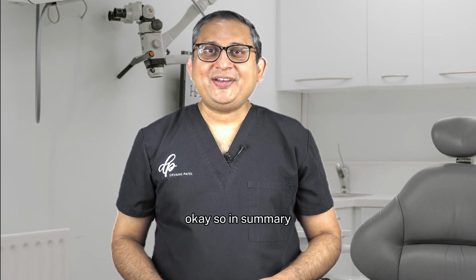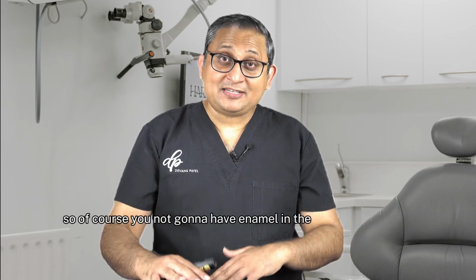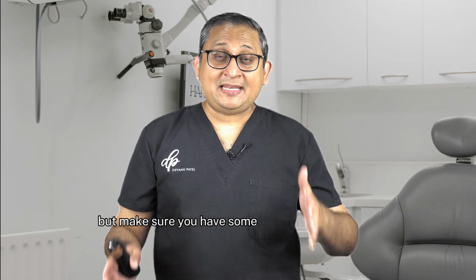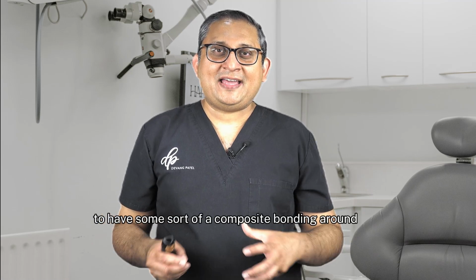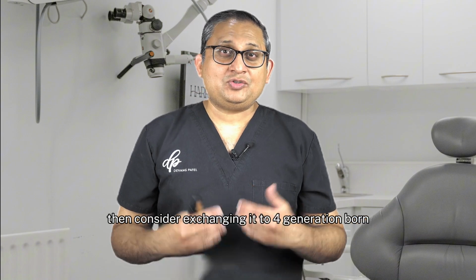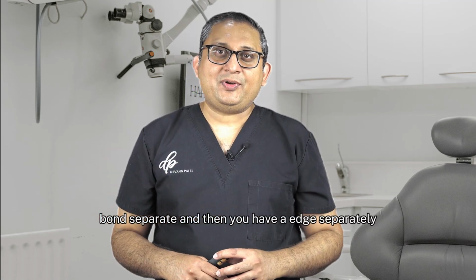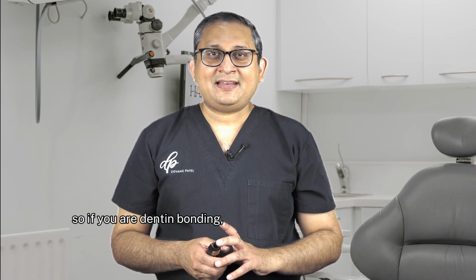Okay, so in summary, you need to make sure that you have a very good enamel around the tooth. So of course, you're not going to have enamel in the interproximal area, but make sure you have some enamel buccal, lingual, to have some sort of a composite bonding around that. If you're using any other bond apart from 4th generation bond, then consider changing it to 4th generation bond. So I use OptiBond FL, which is basically primer separate, bond separate, and then you have an etch separately. So if you are doing dentine bonding, then I prefer 4th generation bond, which works really well.